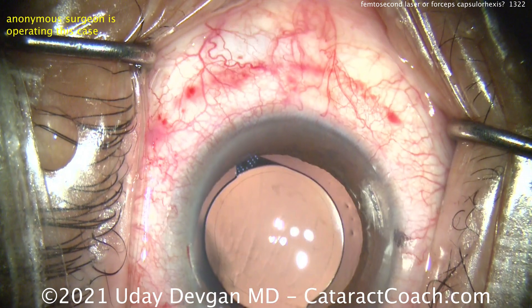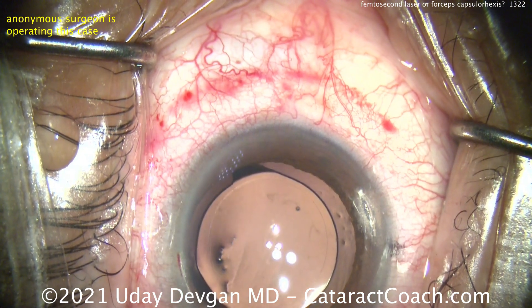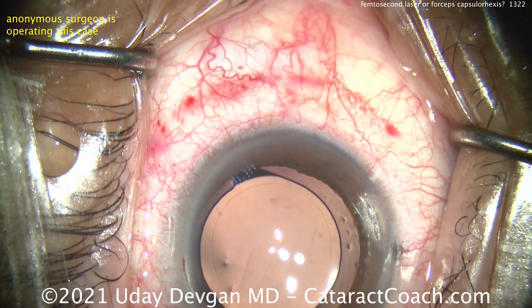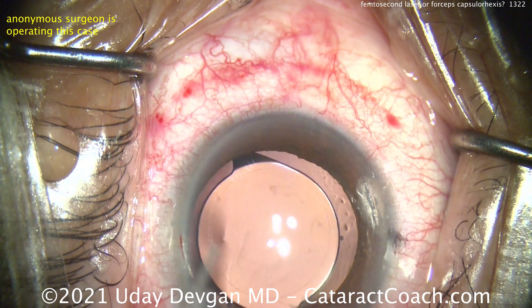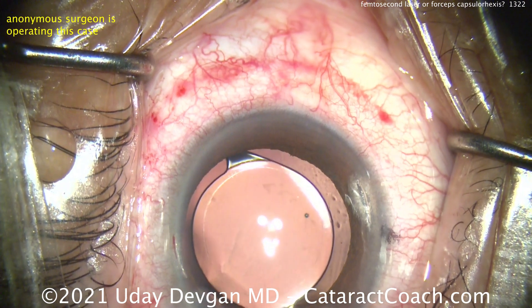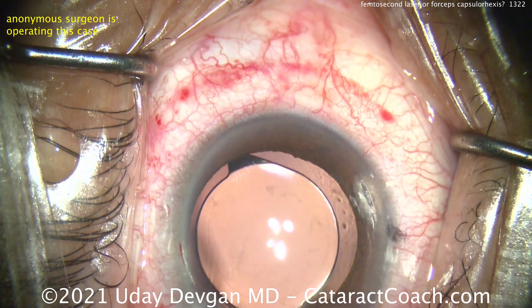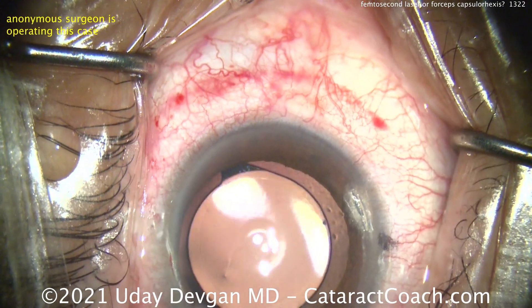Important lessons: if you're a patient watching this, it's more important to find the right surgeon than to do Google homework worrying about whether it's a laser or forceps. We all know the chef is more important than the kitchen — a good chef can make an amazing meal in just about any kitchen. Same with surgeons.